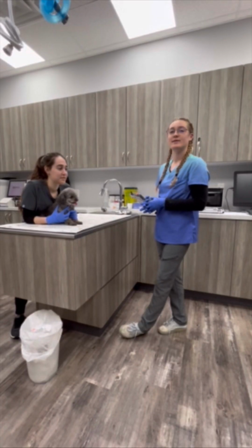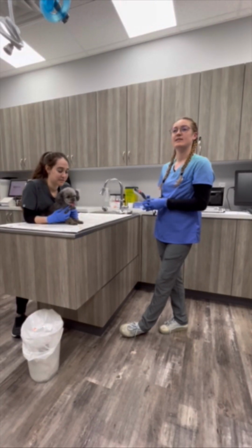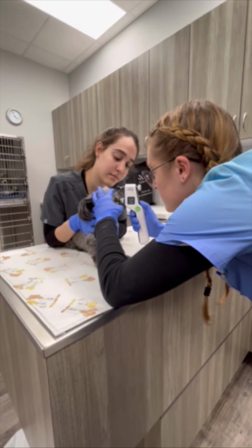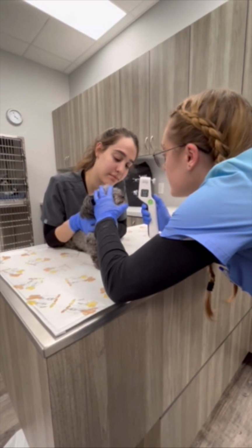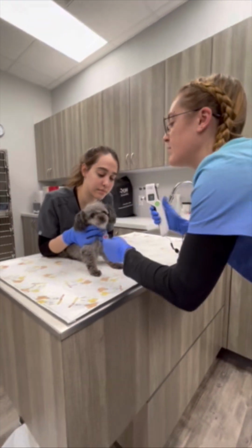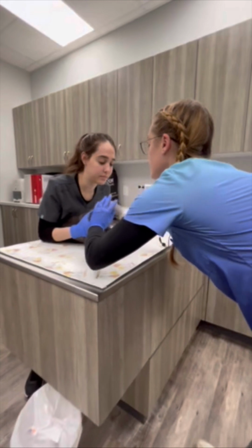I'm now performing a tonometry test to check the eye pressure of the patient. 17, 18. I'll be repeating this on her right eye.